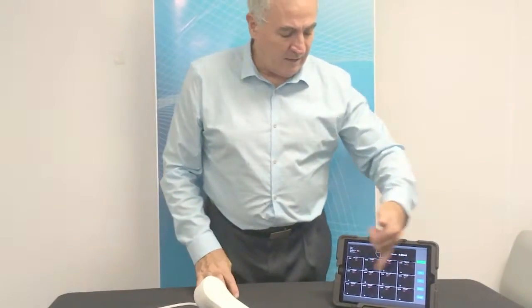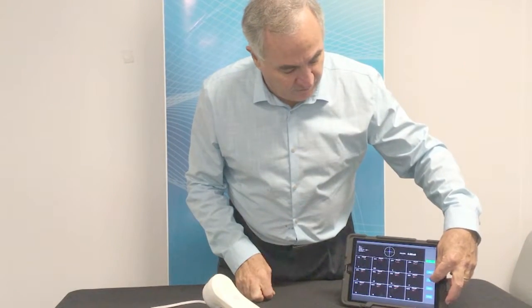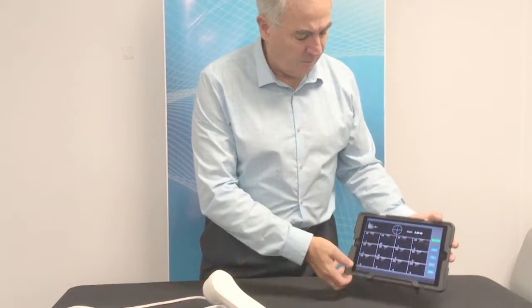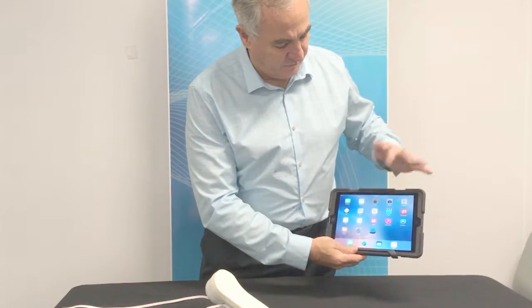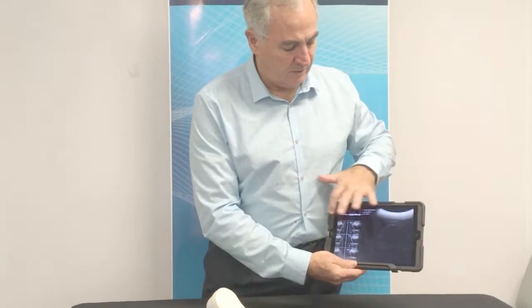You can then activate any of those measurements to full size, or you can save the data to your tablet. Once the data is saved, you can come out of your tablet into your photos and there's your data available. You can then scroll through the patients to view previous data. Patient ID is on the screen in the top left hand corner.